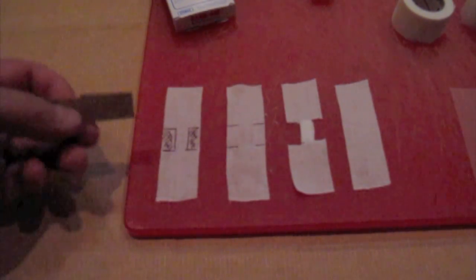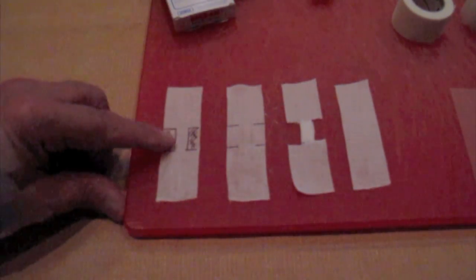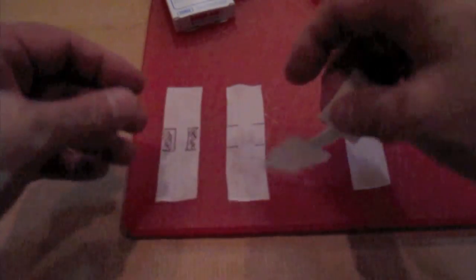What we're going to do is make cuts to form this non-adherent bridge. One option that you can use is the width of this cardboard wrapper for your single edge razor blade. It's a good thickness for a bridge for wounds out in the field and will yield something that's easily managed. So I've used that as a gauge. These are the pieces that we're going to cut and fold back to yield this butterfly. And you'll see that there's the two anchors and a non-adherent bridge.